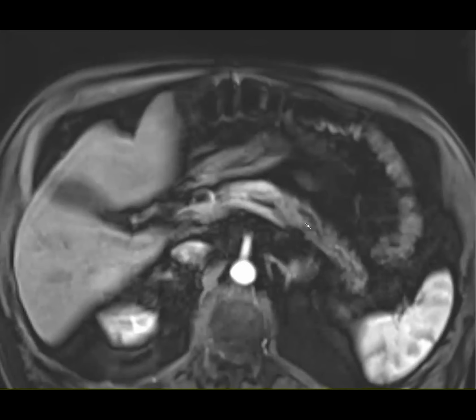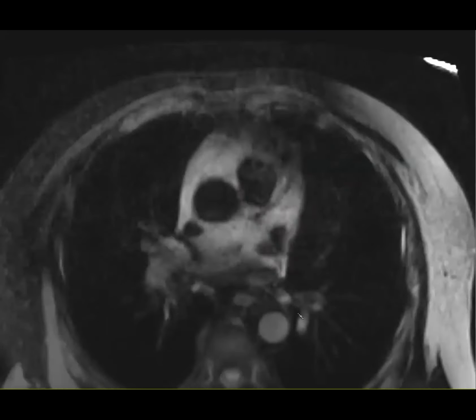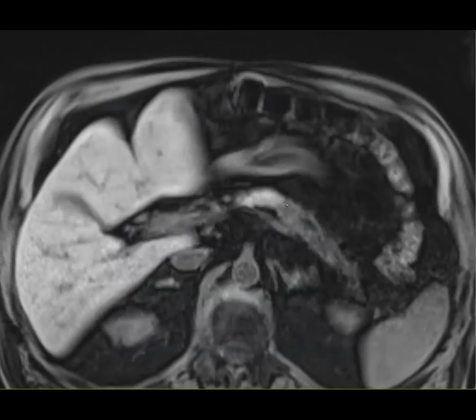And then this is the arterial, and you can see the duct, and then maybe a hypoenhancing area, and then this arterially enhancing stuff. And when you correlate with the pre, that's right where you see the duct, then this, then the nice bright normal, even the atrophic pancreas. So anyway, this was biopsied, and this was pancreatic cancer.